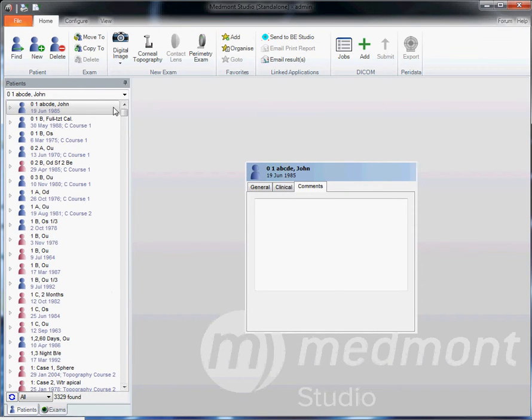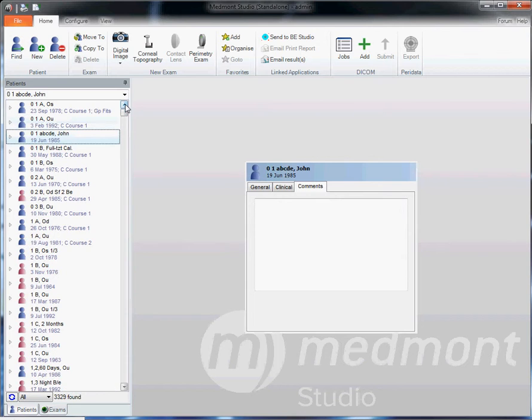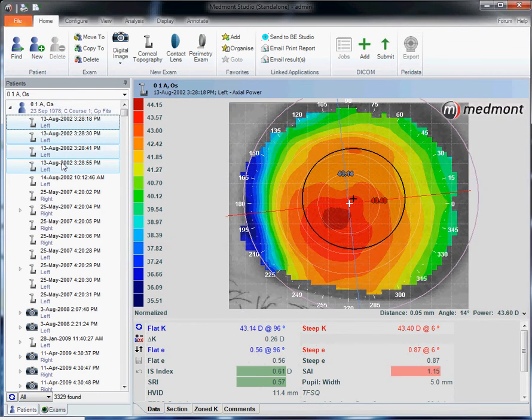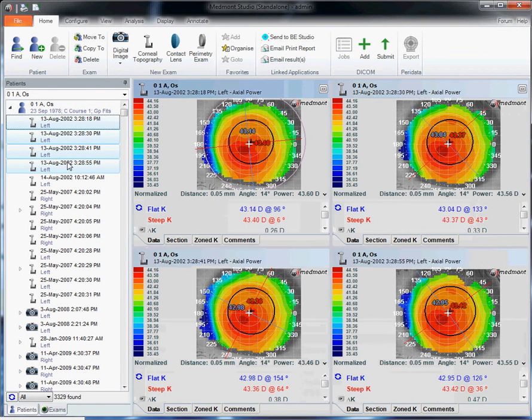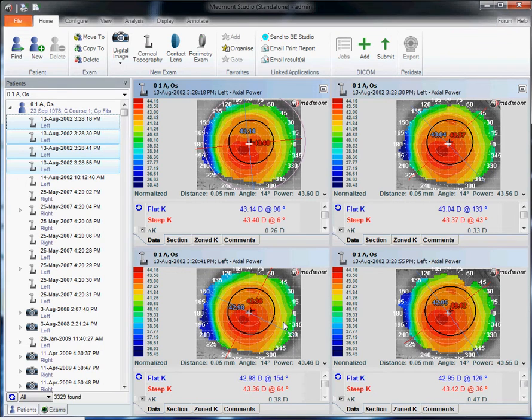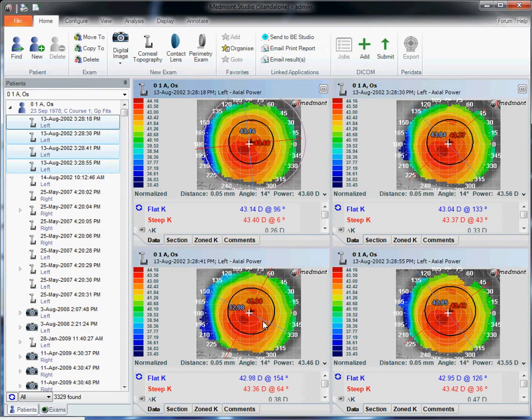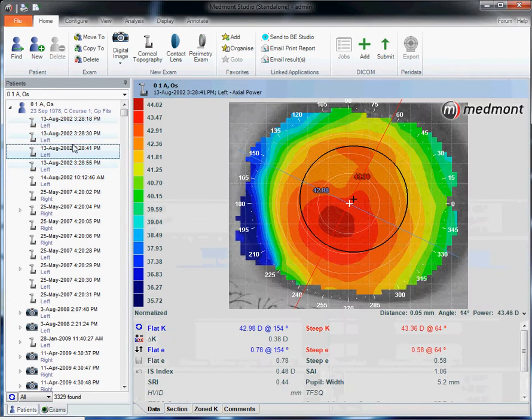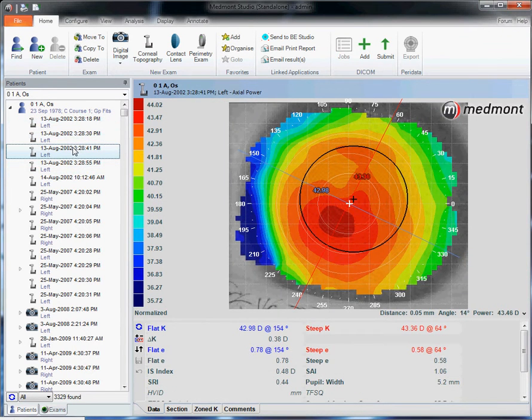If you do orthokeratology as an example, you may find it beneficial to highlight a specific topography. For instance, if we look at these four topographies and want to choose our best baseline, our map that we will reference at all future visits, we may want to choose the best topography and label it as being the most appropriate or best baseline.